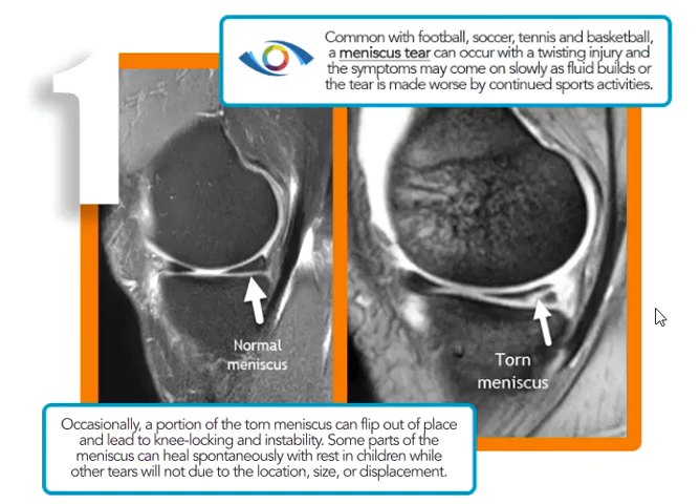Now this is probably the most common thing we see. This is a tear of the meniscus. This is a side view of the knee. Up here this round area is called the femoral condyle — this is the medial or inner side, the medial femoral condyle. Below this is the tibial plateau, this horizontal band. So tibia and femur: the femur is round, the tibia is flat, and between those you see this little wedge — this is called the medial meniscus.